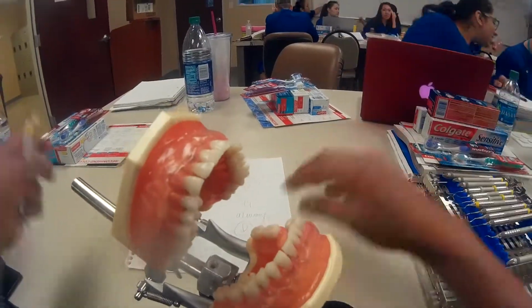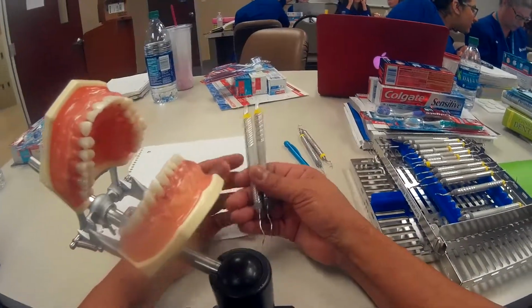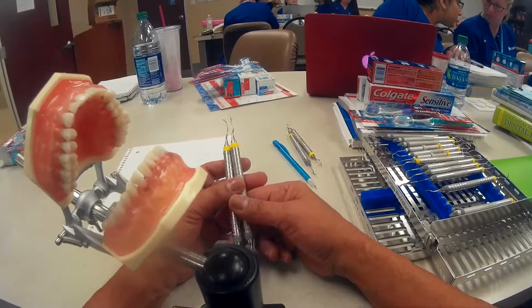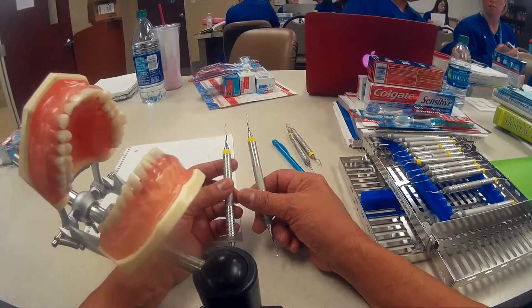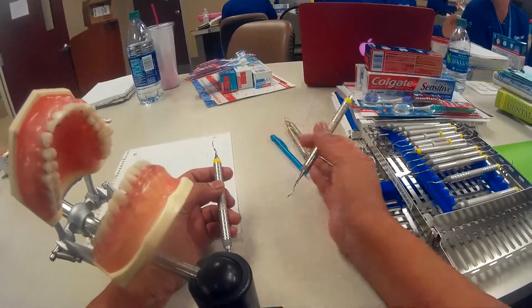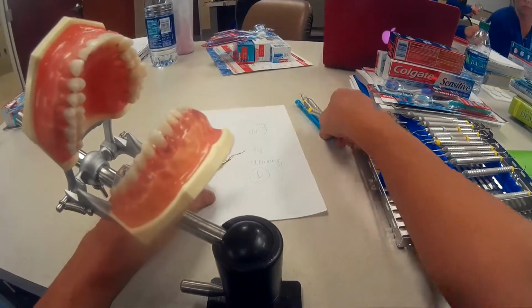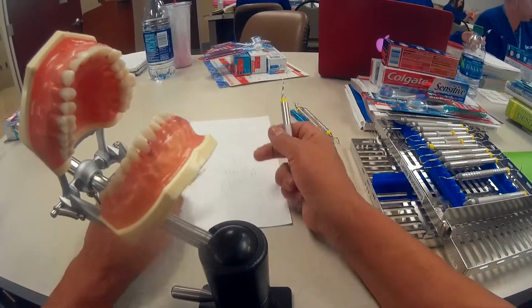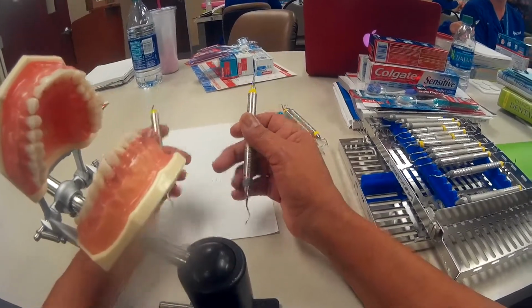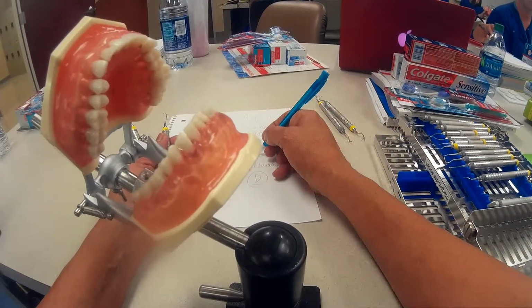All right, so now I'm going to explain a little bit more about these modified, and we call them modified Gracies, because what they've done is they've taken the traditional 11/12, which is only for mesials. If you look in any of your catalogs or in some of the other booklets and pamphlets that I've given you from Hu-Friedy, it shows the 11/12 designated only for use on a mesial surface. And then a 13/14 is always designated only for a distal surface.